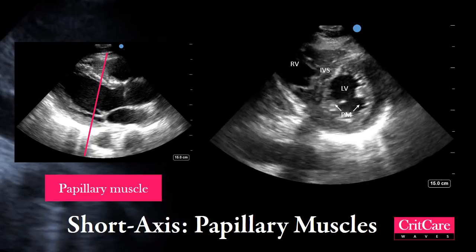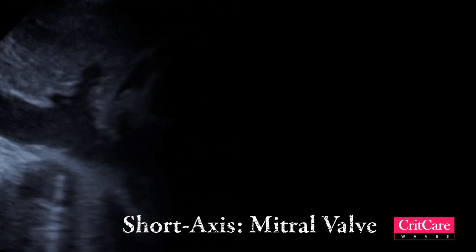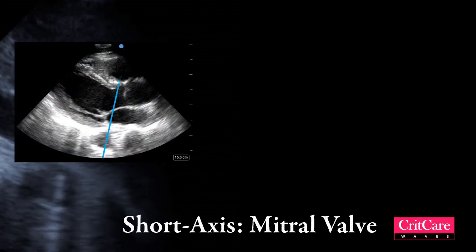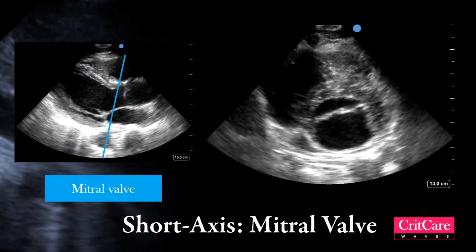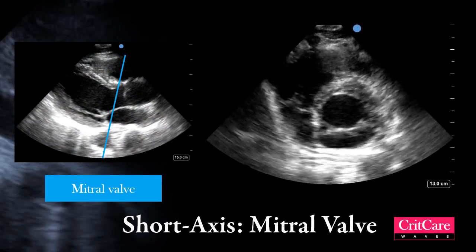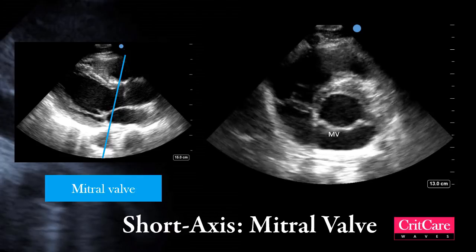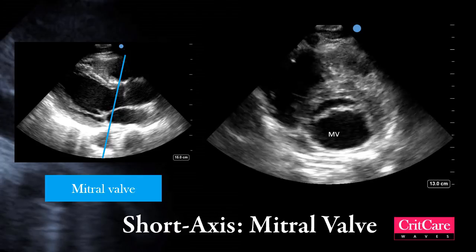The next view is at the level of the mitral valve. The fish mouth appearance of the mitral valve within the left ventricle can be seen, and the right ventricle is to the side.